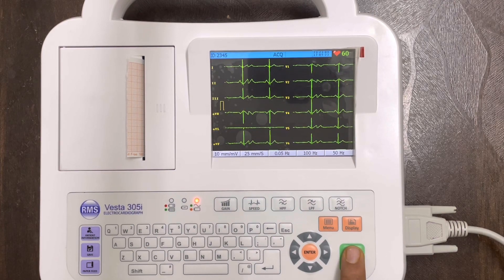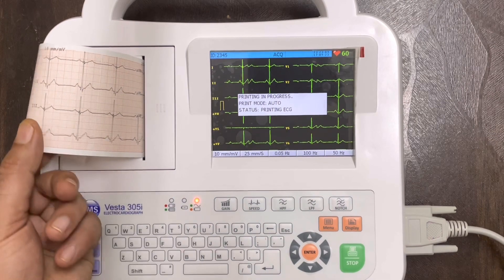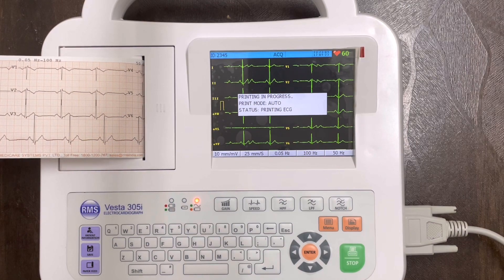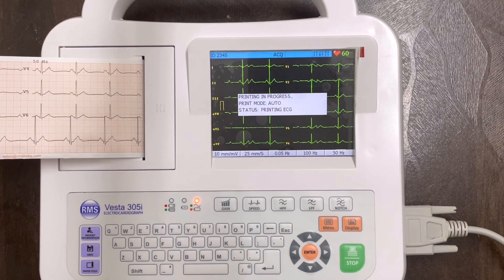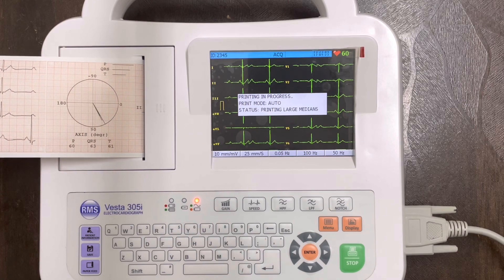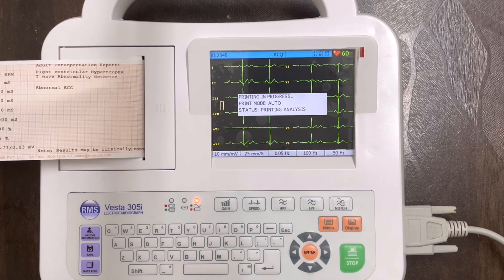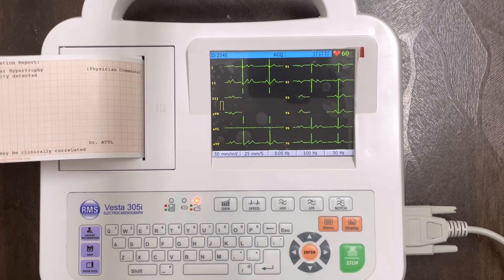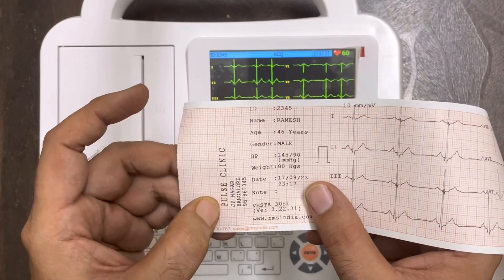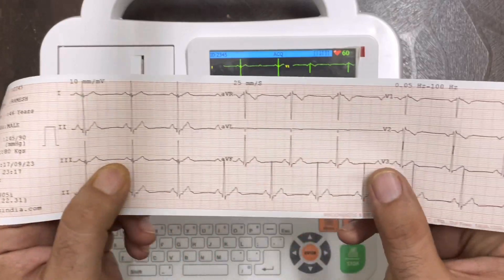Now press the green color button to get the ECG printout. The print we are getting includes: first, the clinic information; then patient information; then all the waveforms; then the axis graph; all parameters; interpretation; and at the end, the doctor can make comments. This is a full review of the ECG printout — first clinic information, then patient information with date and time.